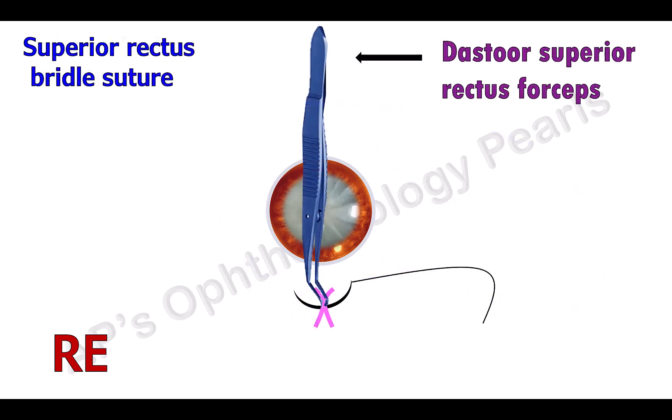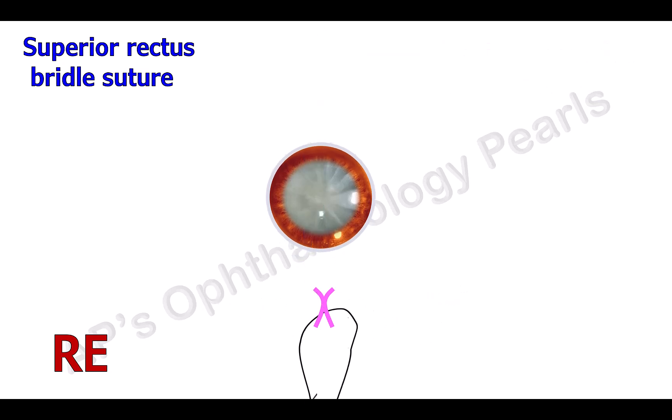Here a superior surgical approach is demonstrated. A superior rectus bridal suture is applied while holding the superior rectus tendon with the Dastur superior rectus forceps, so as to turn the eyeball slightly inferiorly to maximize surgical exposure.